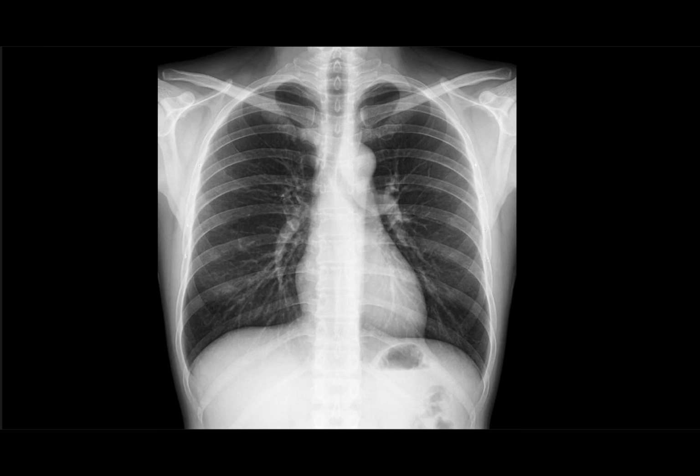Going forward to identify other structures, this is the left clavicle. I call this the left part because of the heart, and then the left dome of the diaphragm, which is lower than the right dome. So this is the left part. This is the left clavicle. This is the right clavicle.